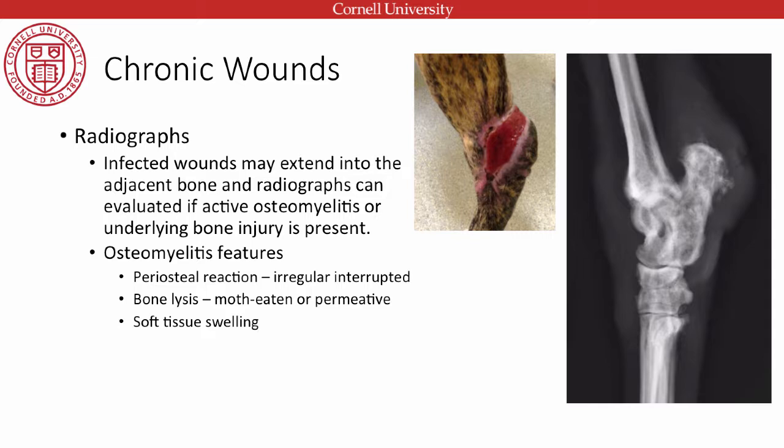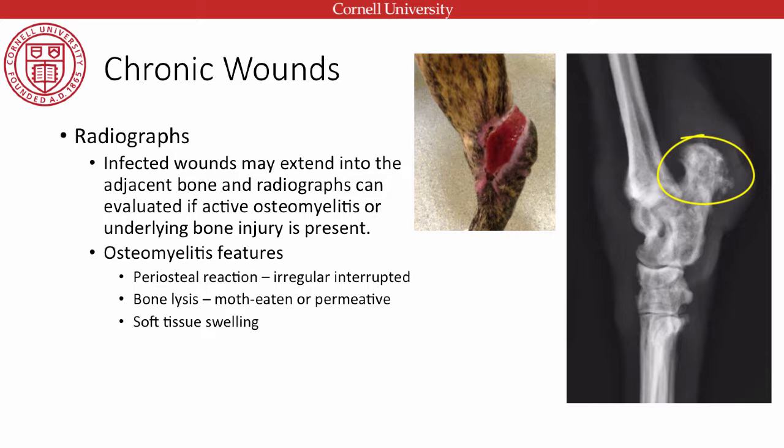Signs of osteomyelitis we look for include a periosteal reaction, often irregular and interrupted. In this example of calcaneal osteomyelitis, we can see lumps of spiculated new bone formation on the calcaneus, which also has a slightly lytic, moth-eaten appearance — that's due to bone lysis secondary to infection — along with localized soft tissue swelling. This dog has a wound right over the tarsus, resulting in underlying osteomyelitis, which will change our antibiotic choice.